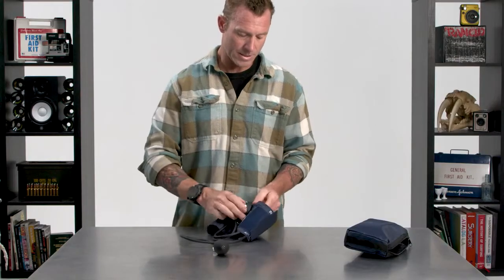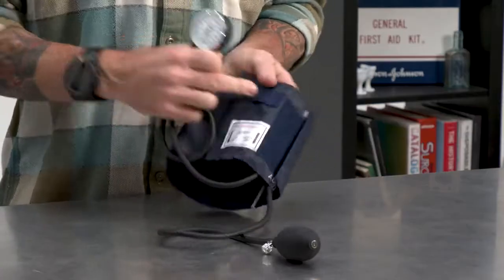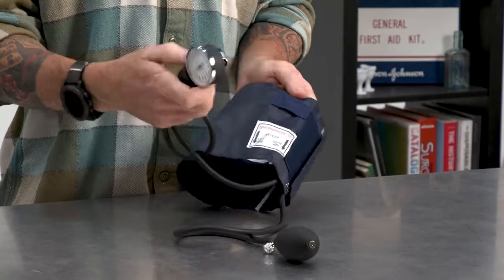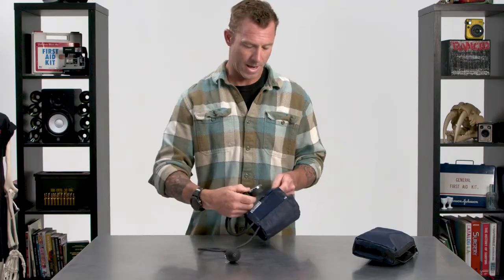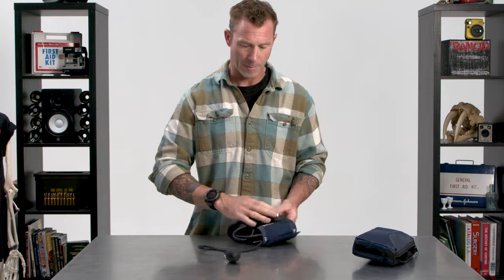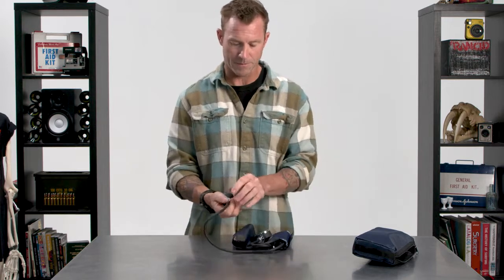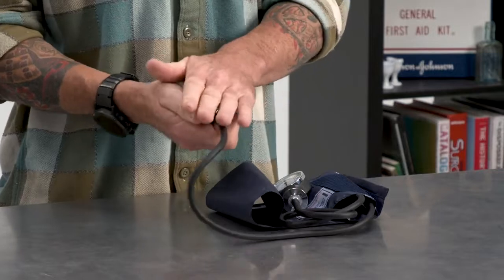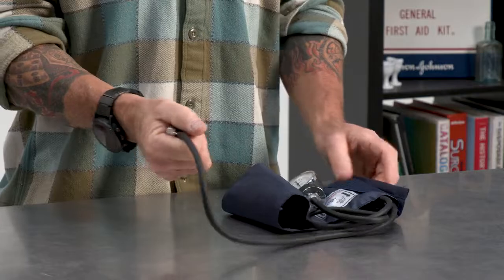You've got your gauge here, and this does come unclipped if you choose to do so. It's got a little tab here you can clip into. So if it's easier and more convenient in certain situations, you can hold this, hang it, whatever. That does come off. And then you've got your bulb to inflate the cuff itself, and the knob here to close off or open the airway through the tubing. Very straightforward.